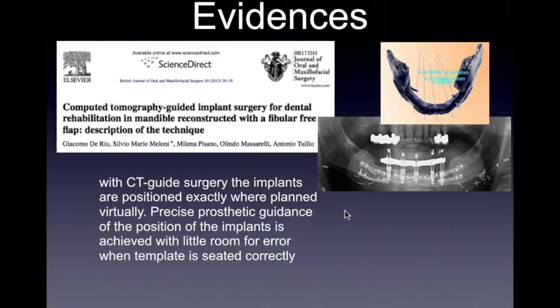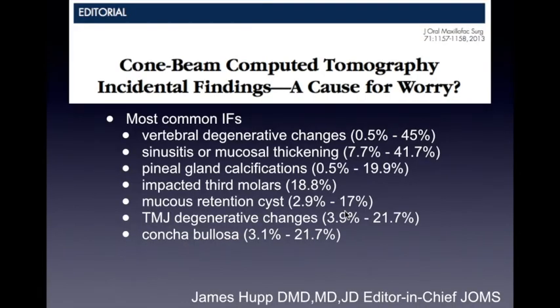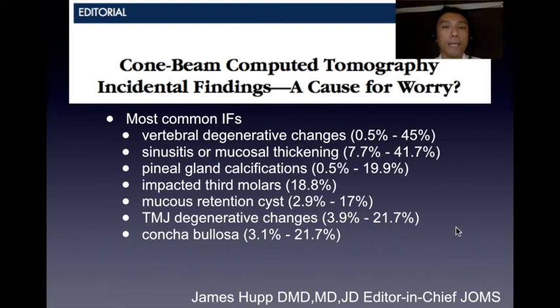Done properly, planned properly. And we go to this particular summary given by James Hupp, one of your maxillofacial surgery editors, authors. He is the editor of the Journal of Oral and Maxillofacial Surgery. And in one of the editorials that he made, he looked into cone beam CT scans and incidental findings.